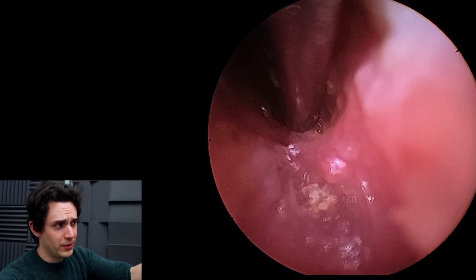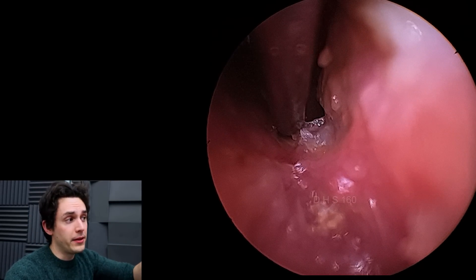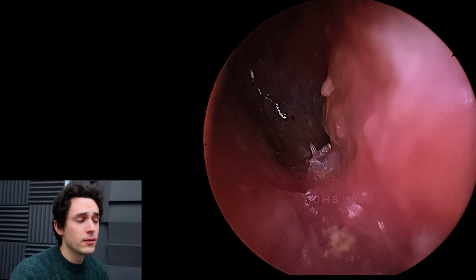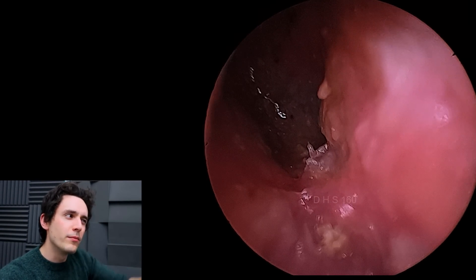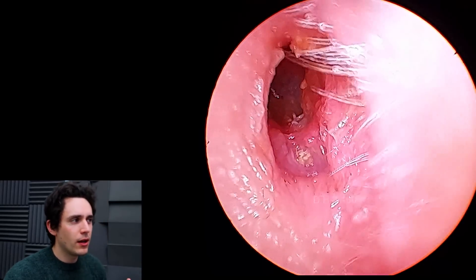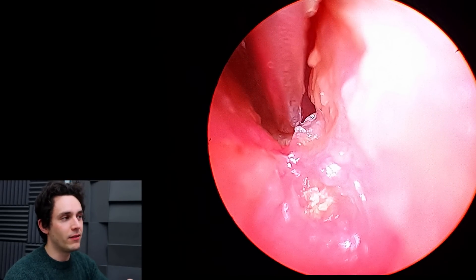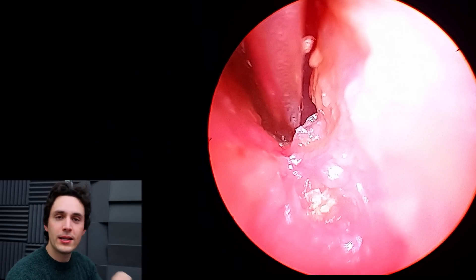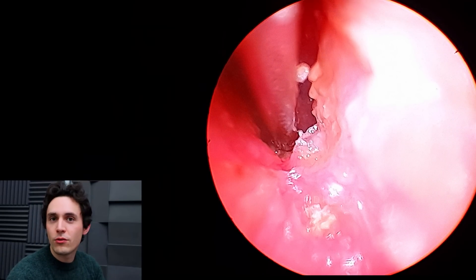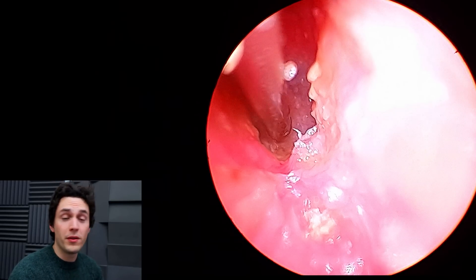I'm pretty sure I just sucked up a little bit of sequestra there as well. But we have further erosion up here and there's exposed bone, which you'll see later on become clearer. So there's not just erosion in the pocket — there's erosion up top as well. I'm assuming that the bacteria living in the ear canal and feeding on the dead skin are releasing enzymes that lyse or break apart proteins, and that's why we're seeing erosion or the skin deteriorate to the point where there's exposed bone.